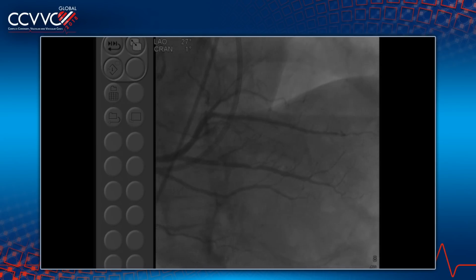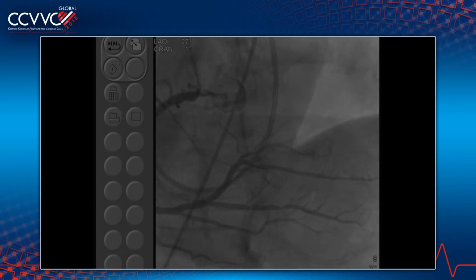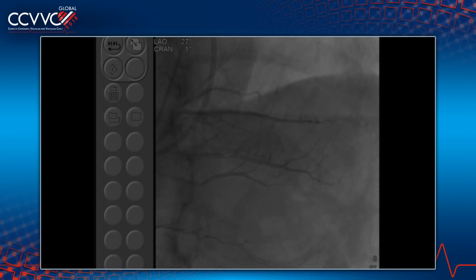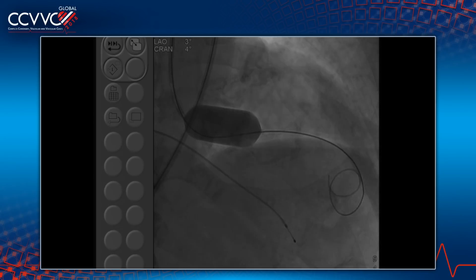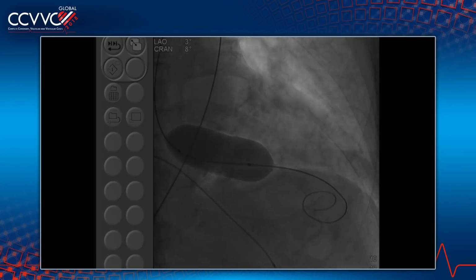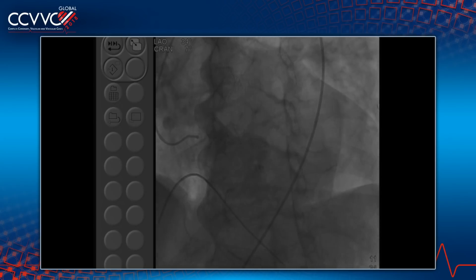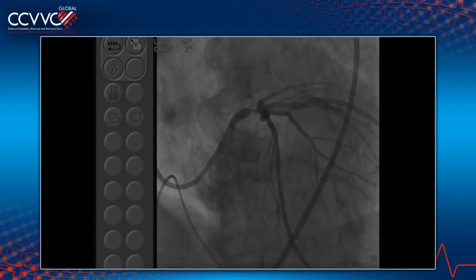Can we show the picture? They see it. Good, so that's the pre-gradient. Then we did a 20 and 22 millimeter valvuloplasty. The post-gradient became about a third: the 90 gradient became about 35, no AI. And let's come to where the meat, or money, is.